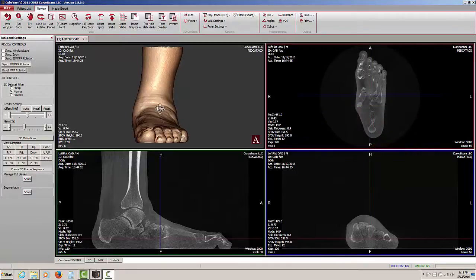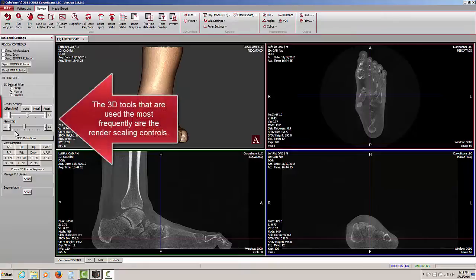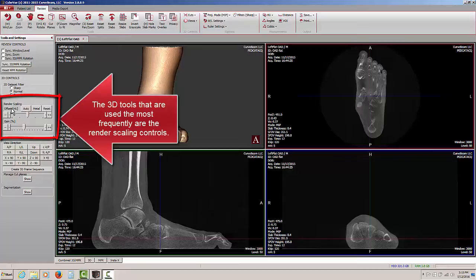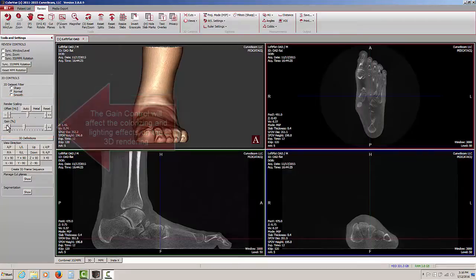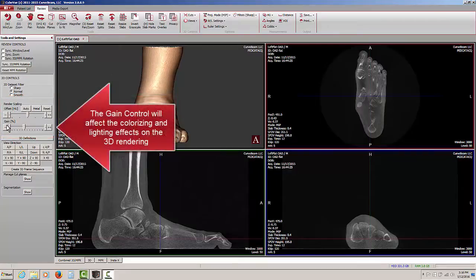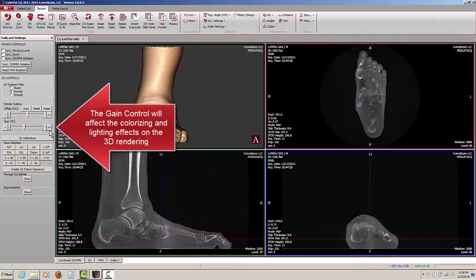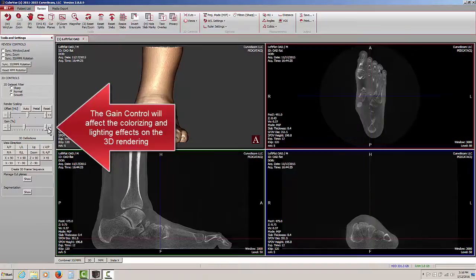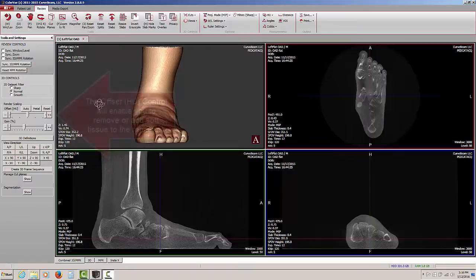Other than rotating the 3D rendering, the tools used most frequently are the render scaling controls over here on the left hand pane. The gain control, when you adjust the slider or press the minus or plus buttons, will adjust the lighting effect and the colorizing effect of whatever appears in the 3D rendering window.